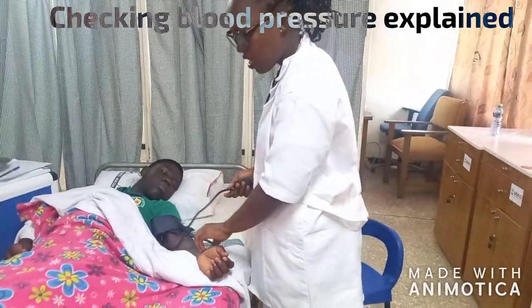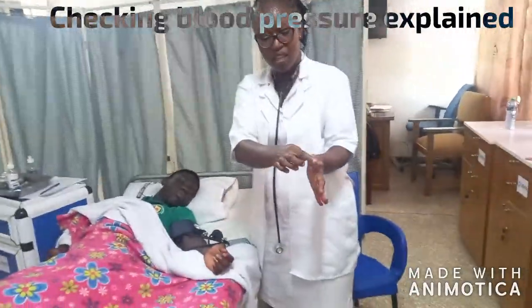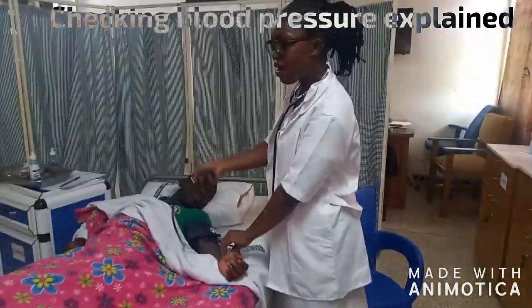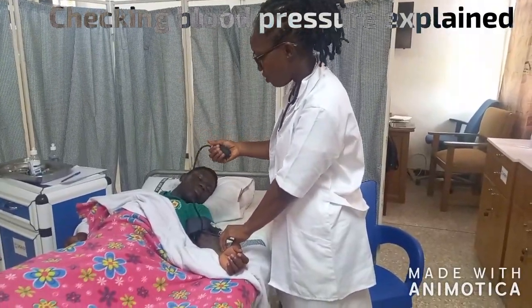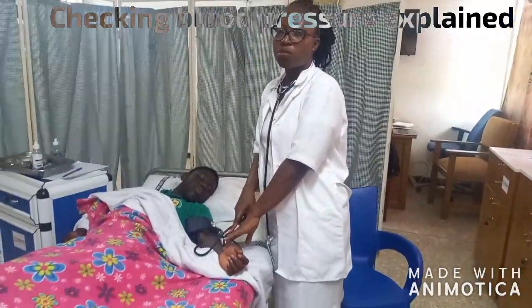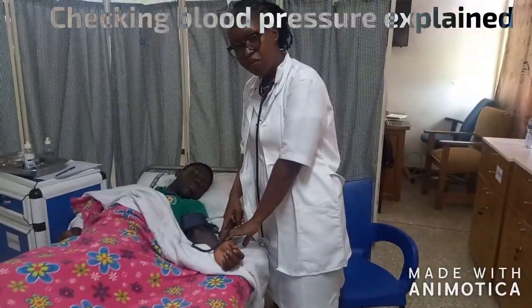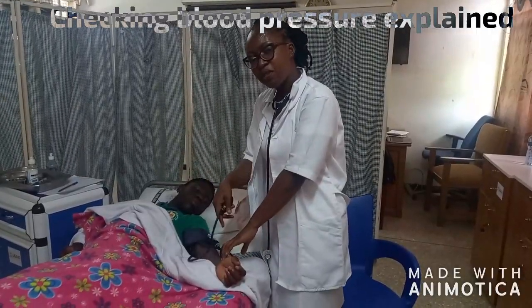This hand will now be on the radial pulse — we are checking. I have the pulse now. You see, just where the thumb is at the wrist area, you check for the pulse. When you get the rhythm, then you close the valve. If you don't close, you can't inflate. You close the valve, now you start inflating, feeling the rhythm of the pulse. You check where the pulse will stop beating — that is where you are expected to hear the first sound. So when the pulse stops beating, you inflate about two more times so that it will go above that point. When you start deflating, expect to hear the sound there.